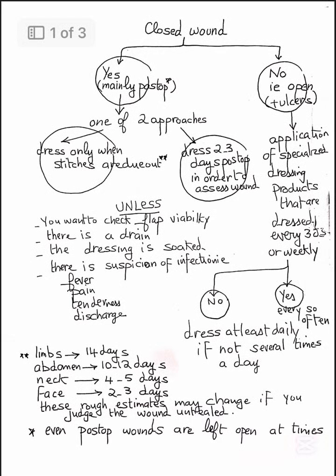For tubes, however, we use the French scale, or F, where 1 French equals 1/3 of a millimeter. For example, a 9F tube would be 3 millimeters in outer diameter. When referring to wires, a standard size is often 0.035 inches in diameter.